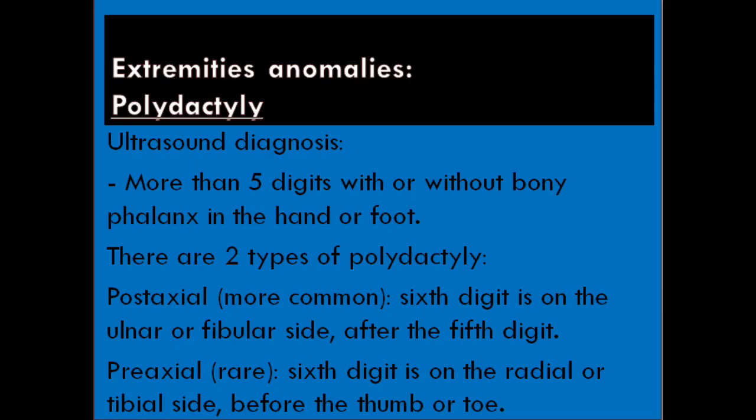The next is polydactyly. Ultrasound diagnosis: more than five digits, with or without bony phalanx, in the hand or foot. There are two types. Postaxial, the more common type, where the sixth digit is on the ulnar or fibular side after the fifth digit. Preaxial, which is rare, where the sixth digit is on the radial or tibial side, before the thumb or toe.